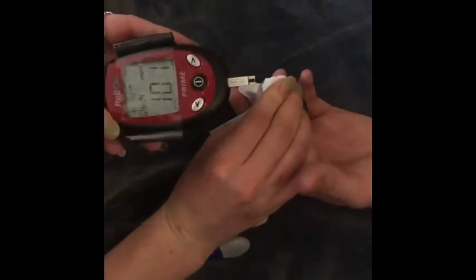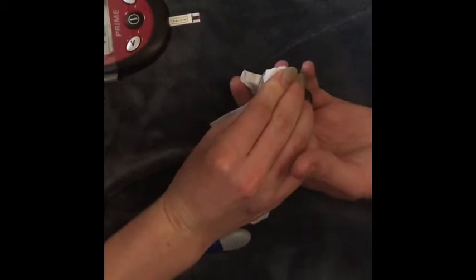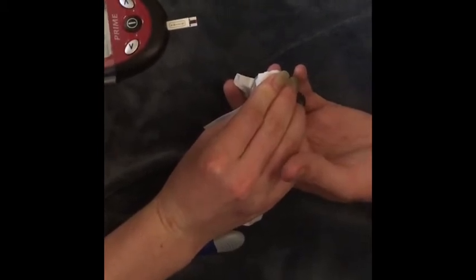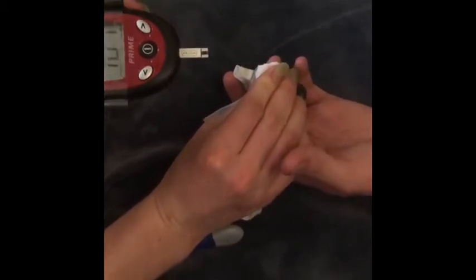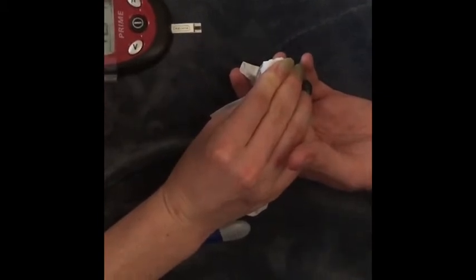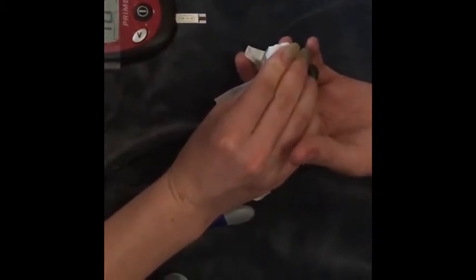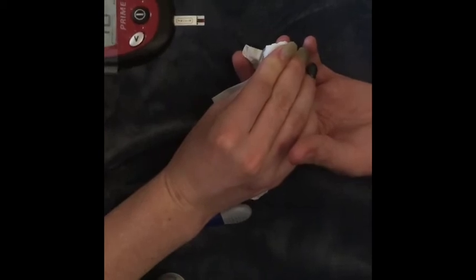His reading is 101, which indicates normal — especially since he ate two hours ago. The normal range for someone tested two hours after a meal is 100 to 140 milligrams per deciliter. Dispose of the lancet by placing it into a sharps container.